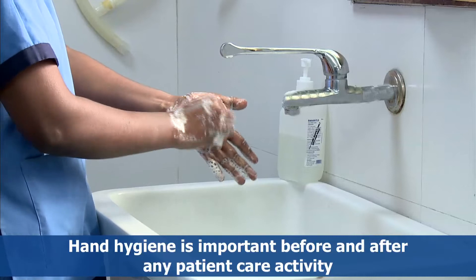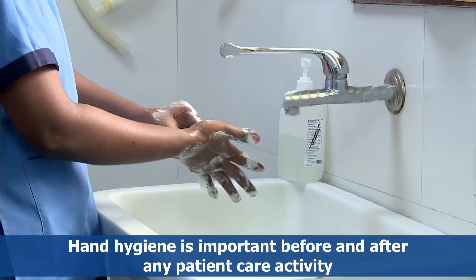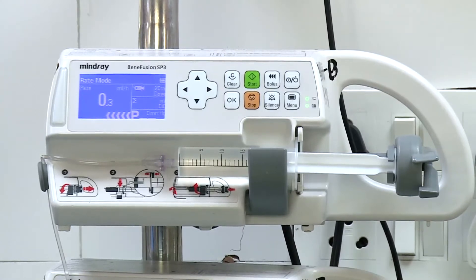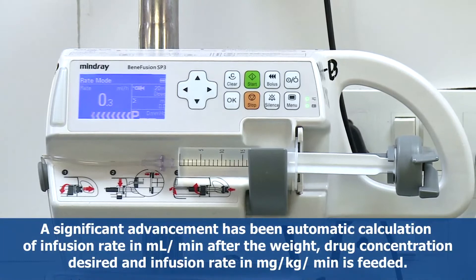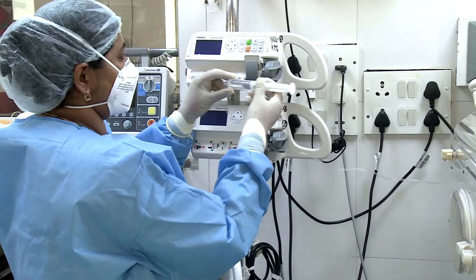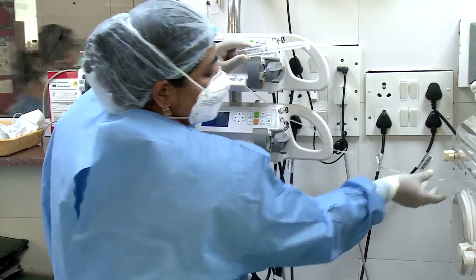In this video we shall demonstrate the procedure for use of a syringe pump. A syringe pump is used for continuous, controlled and accurate delivery of IV fluids and medication. These pumps have the convenience of not requiring specialized tubing. A significant advancement has been the automatic calculation of infusion rate in ml per minute after the weight, drug concentration, desired infusion rate in mg per kg per minute is entered.